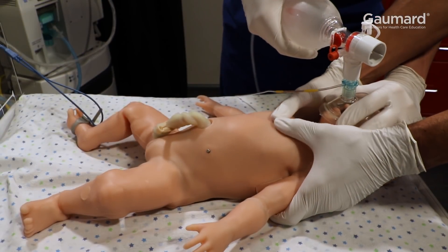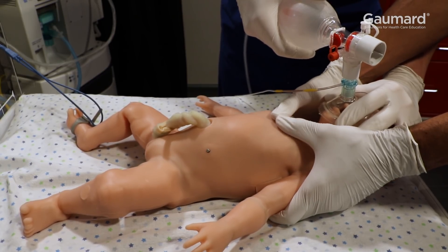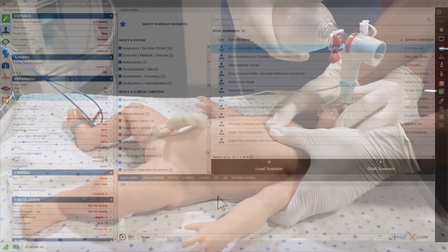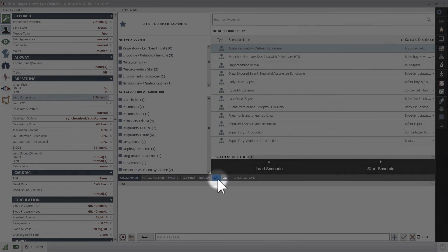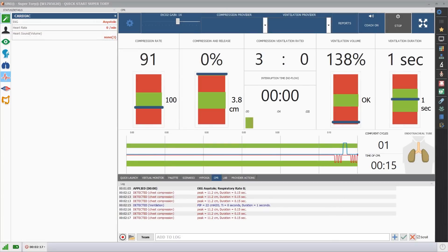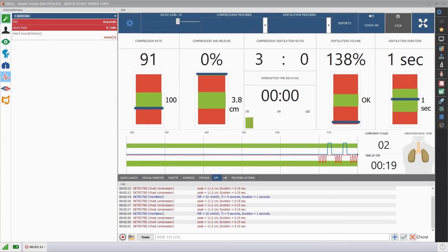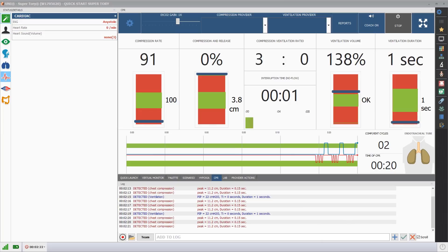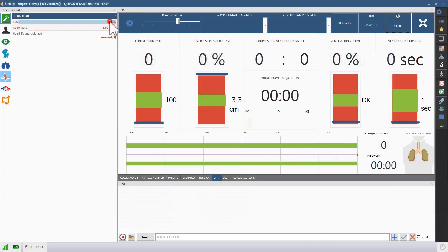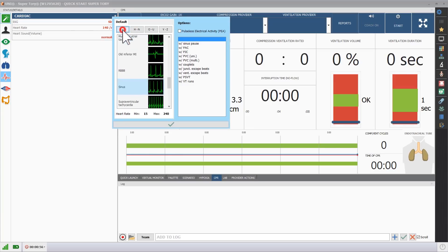SuperTori features palpable landmarks for correct placement of hands during CPR. Open the CPR window to access the eCPR real-time feedback program. With eCPR, instructors and learners can receive real-time feedback on the quality of compression and ventilation depth, rate, and volume. Before starting a session of CPR, apply the appropriate vitals.